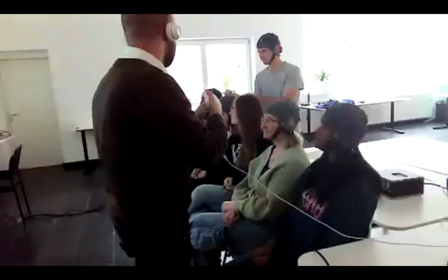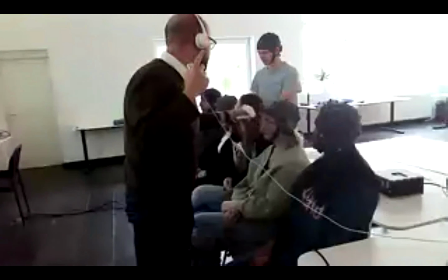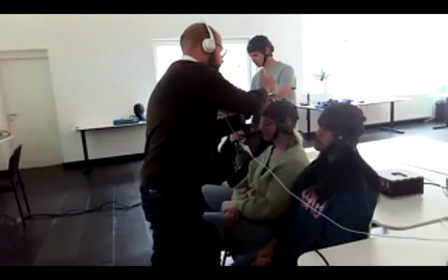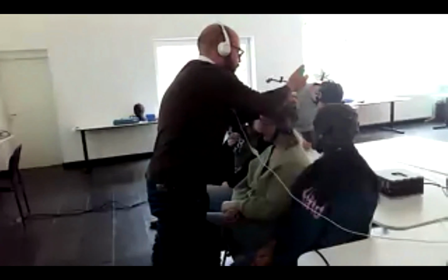MJ, for the g.HIamp, we're using passive electrodes on the neck. You have the clips there. On the neck, sorry, on the mastoid. Good. So I will start by gelling the caps.